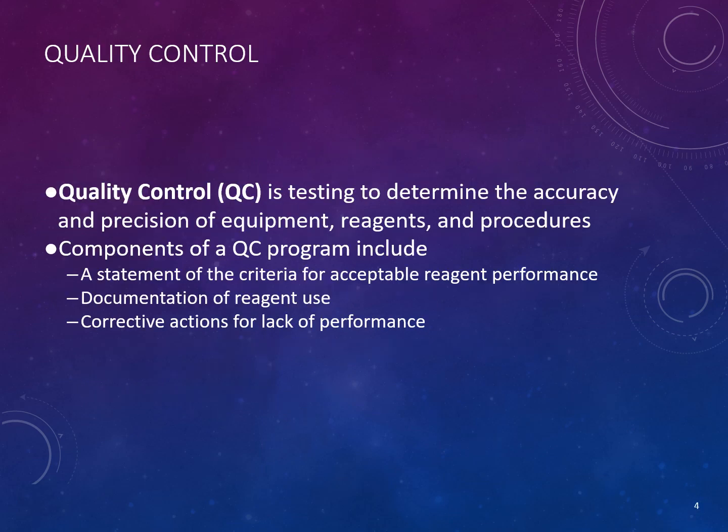Just like any other reagent used in the laboratory, your blood bank reagents must be QC'd daily, and this also includes any of the equipment that you use and any processes that you go through. There must be some kind of quality checks for those reagents and that equipment. An example of an equipment check would be temperatures. You would need to make sure that you are getting temps every day of all of your equipment.